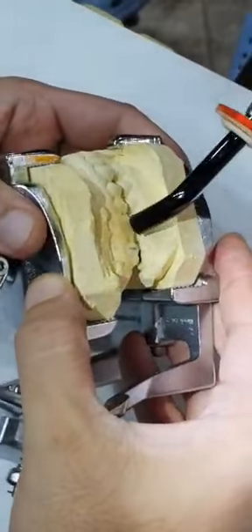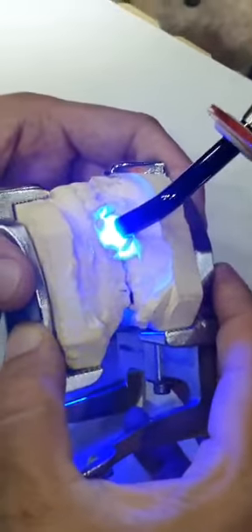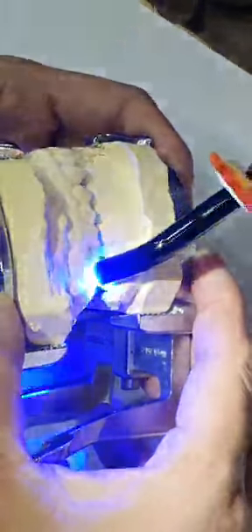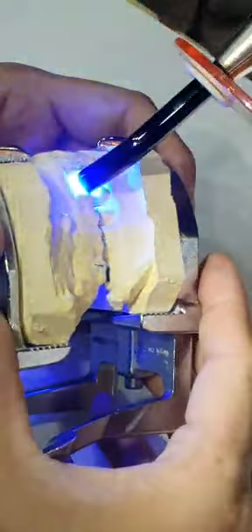Through the open area you cure each tooth. Let the patient bite down tight and now you have the new bite on the right side. Keeping the right side as your guide, you can do the whole segment on the left side the same way. Now both right and left sides are bilaterally balanced and have functional occlusal contact with the functional opposing teeth — the palatal cusps of the maxilla. You are then able to adjust and smooth any irregularities and you have total bilateral balance.